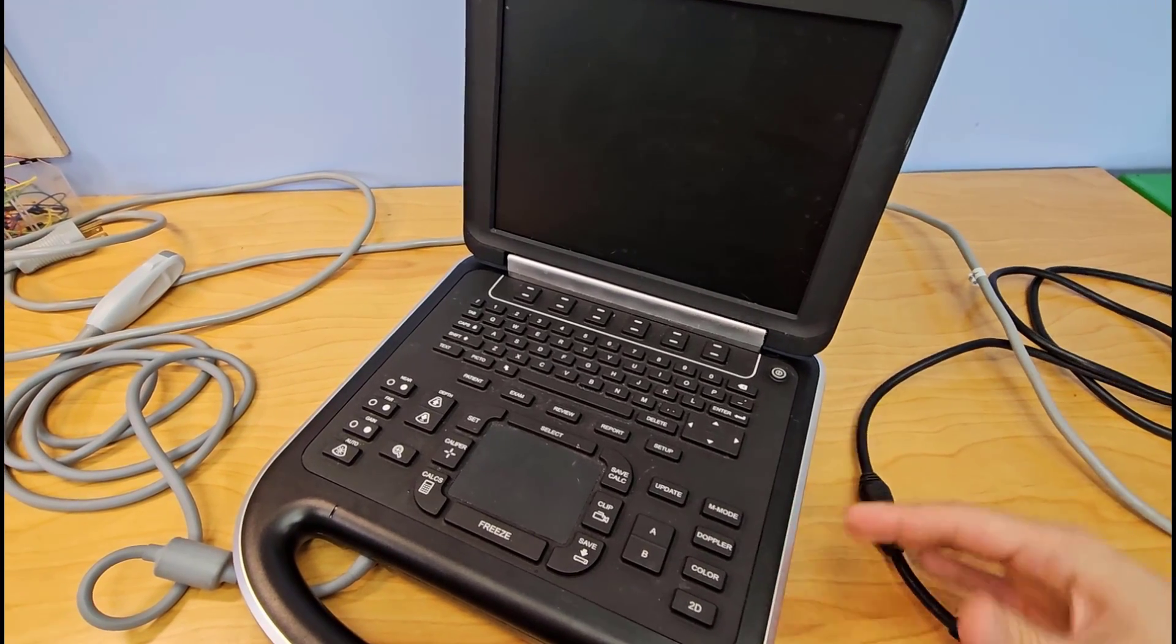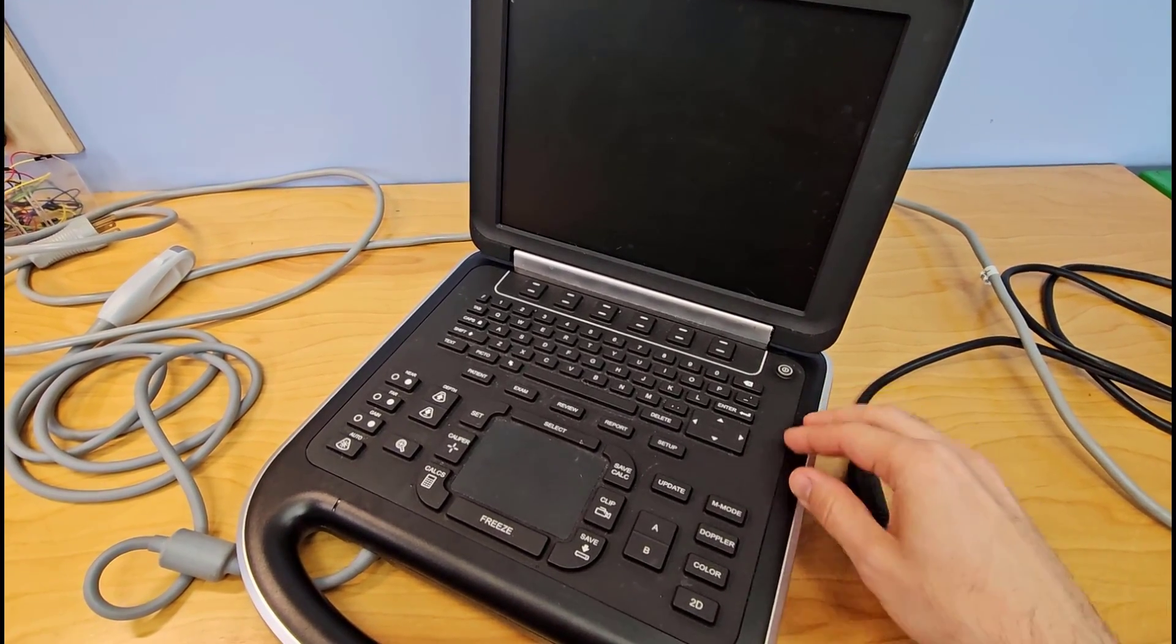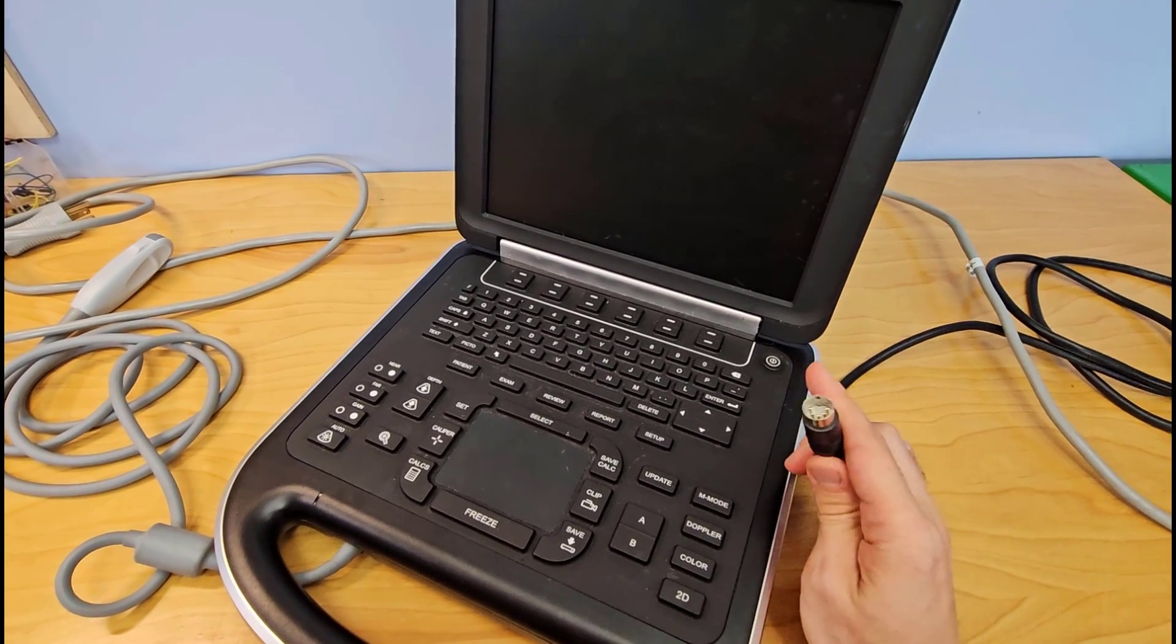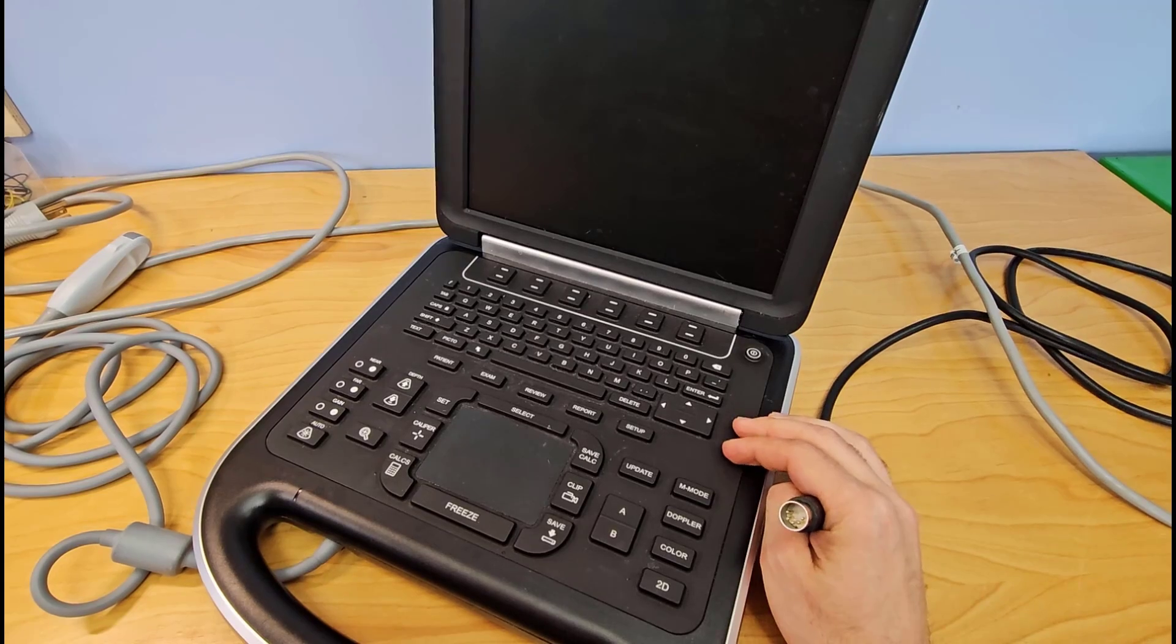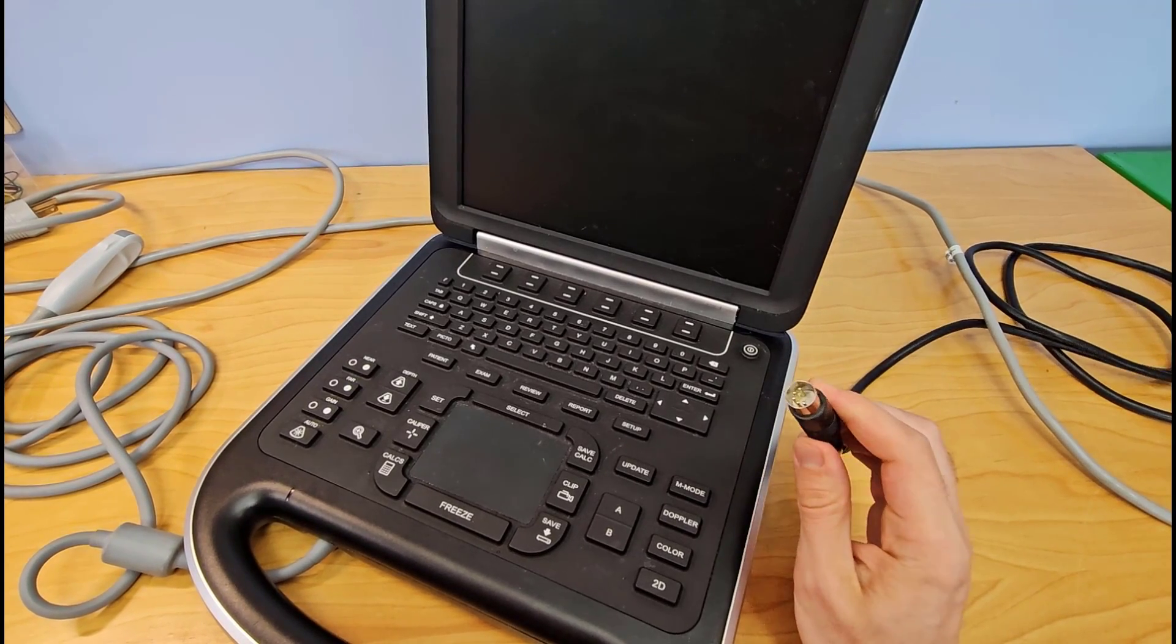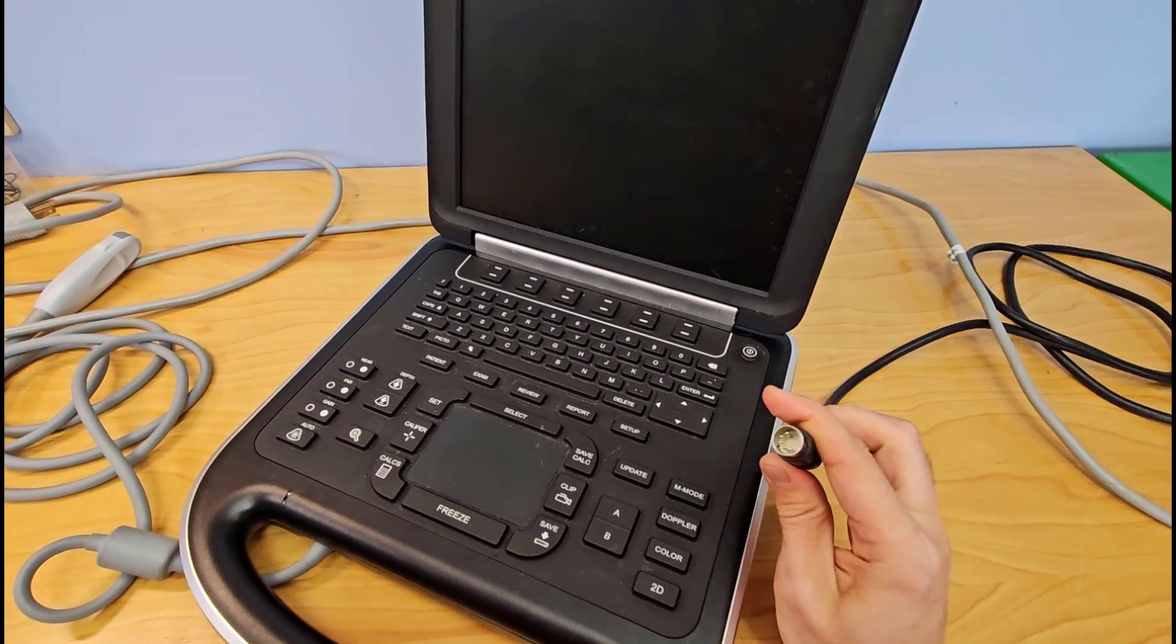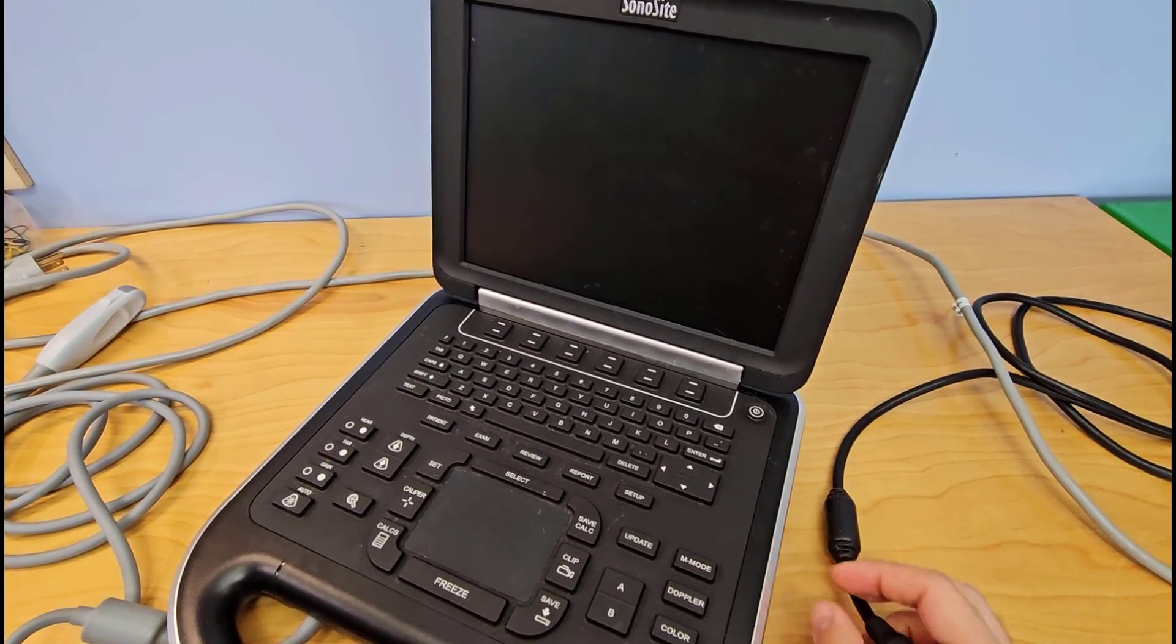They said that since the part that is loose is connected to the motherboard, they would have to replace the entire board. I have a hard time believing that, so we are going to pop the cover off and see if we can just re-solder the connector for this plug into place and get this thing to boot up.